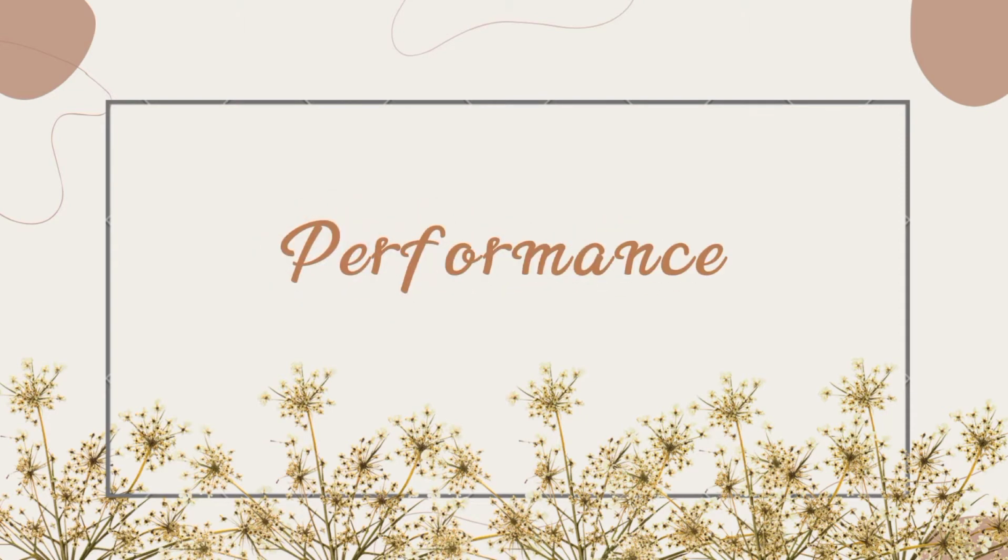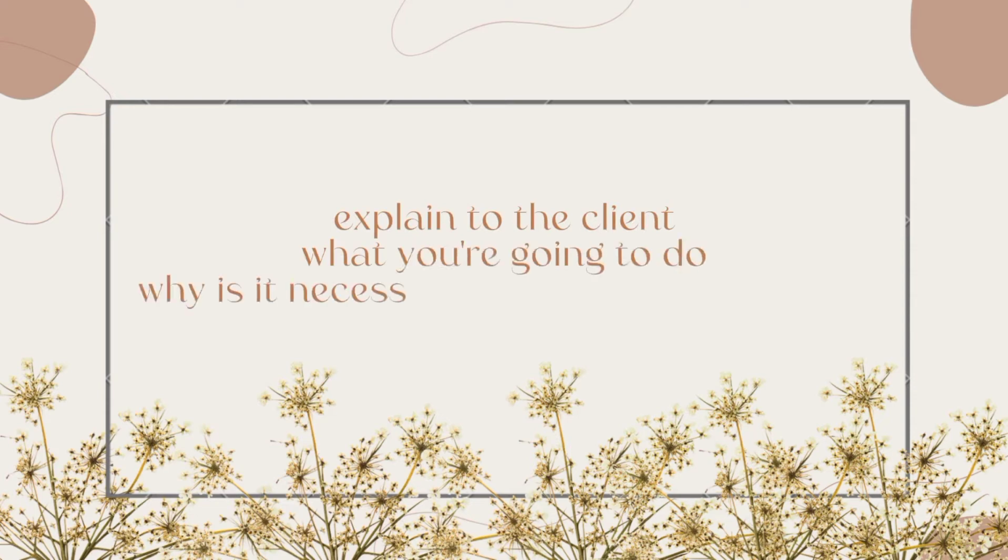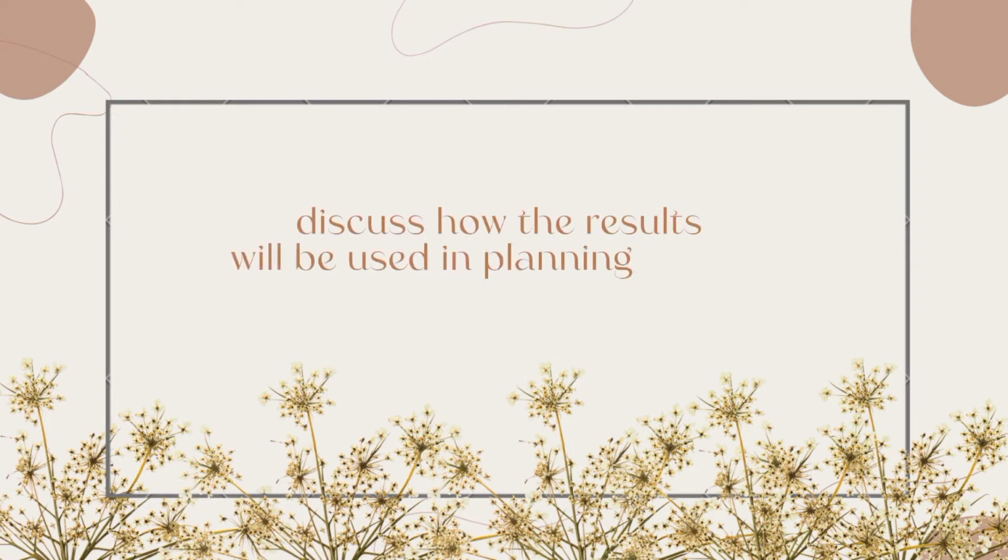For our performance, of course, prior to performing the procedure, we need to introduce ourselves and verify the client's identity using agency protocol. Explain to the client what we are going to do, why it is necessary, and how to participate. We discuss how the results will be used in planning further care or treatments.